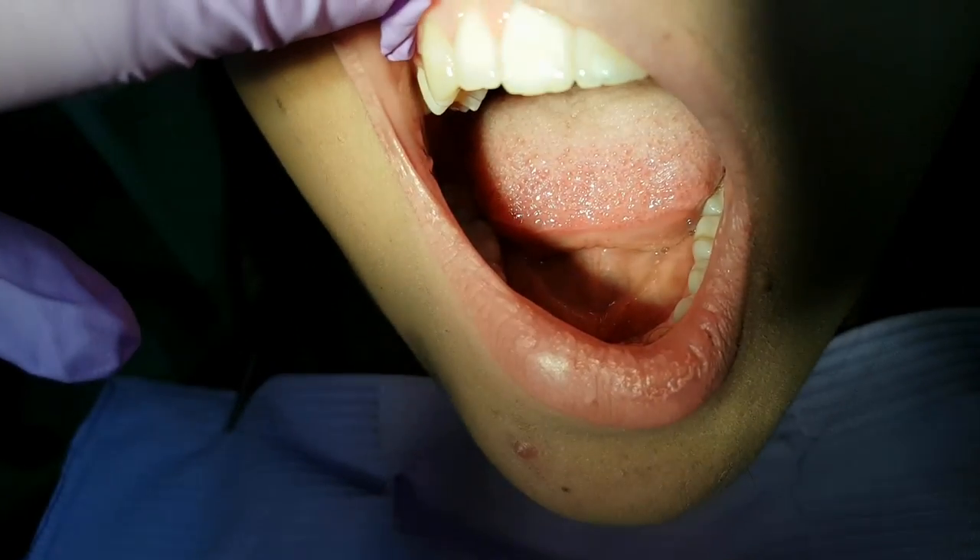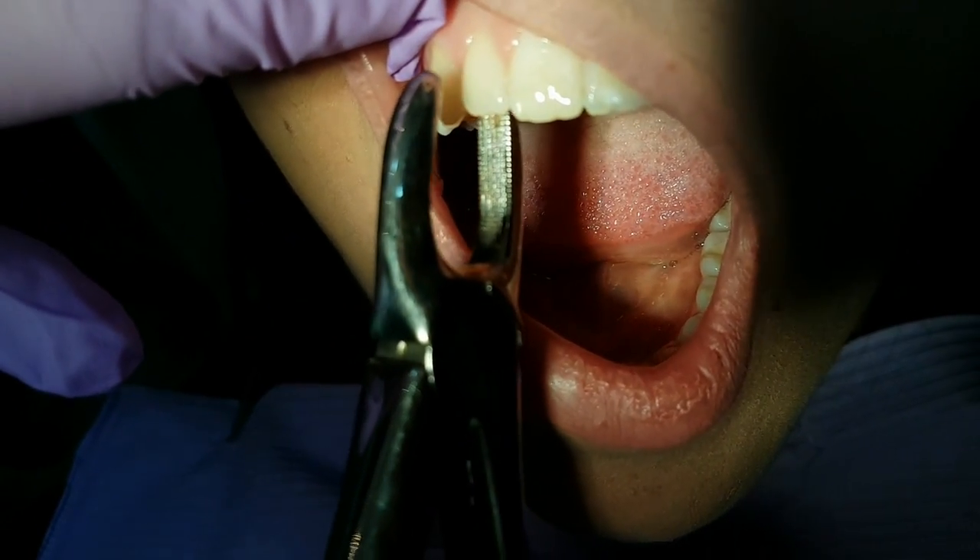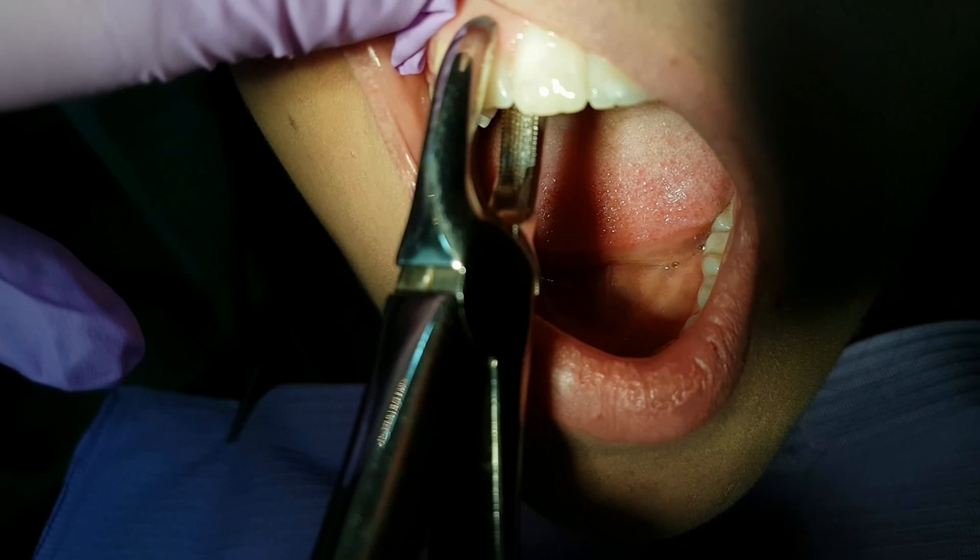Hello everyone! In this video we will show you how to properly use dental extraction forceps in the upper jaw.